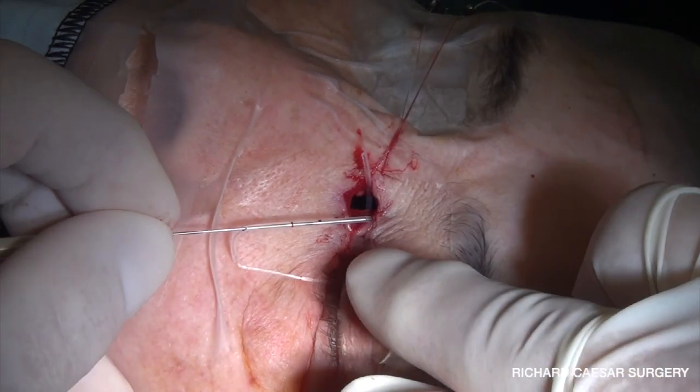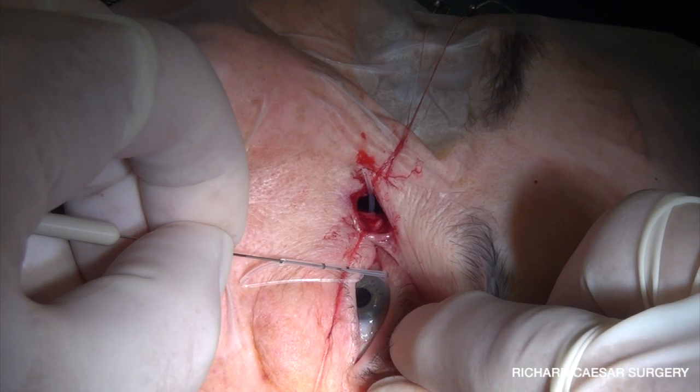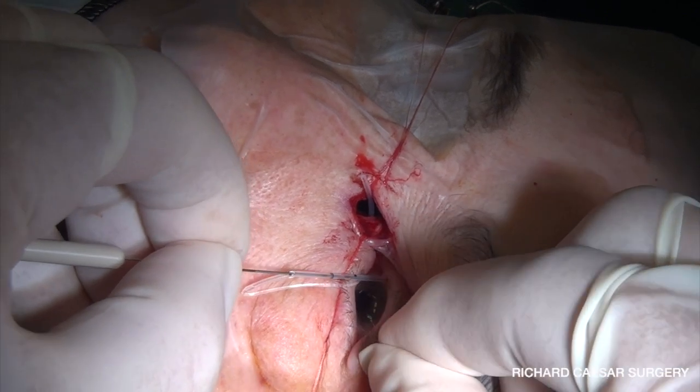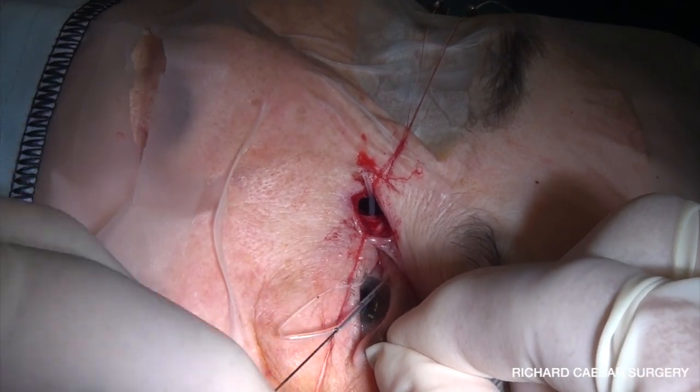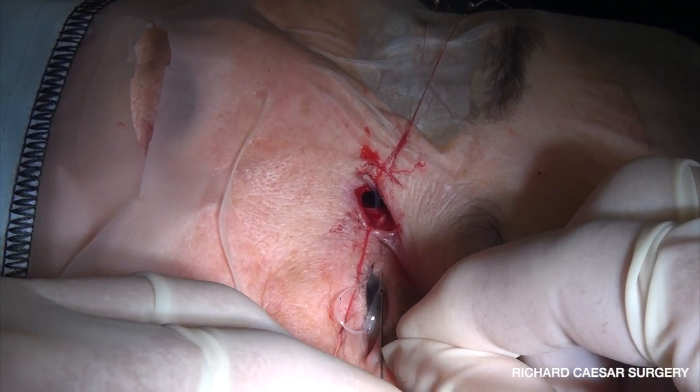To do the same through the upper punctum — again make sure you go into the punctum vertically, put the lid under good tension, go around the corner, pass along the canaliculus, and then you're back in the nose.